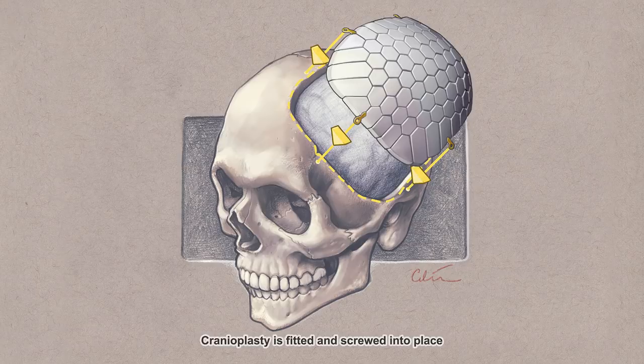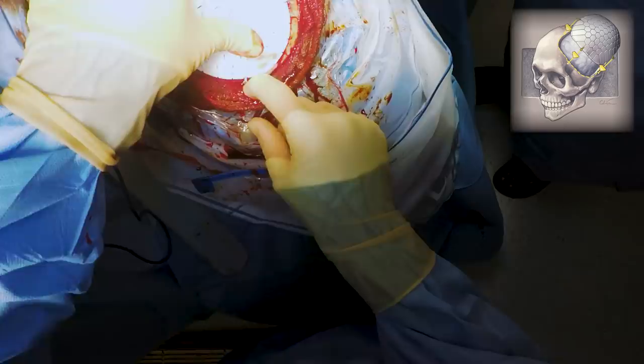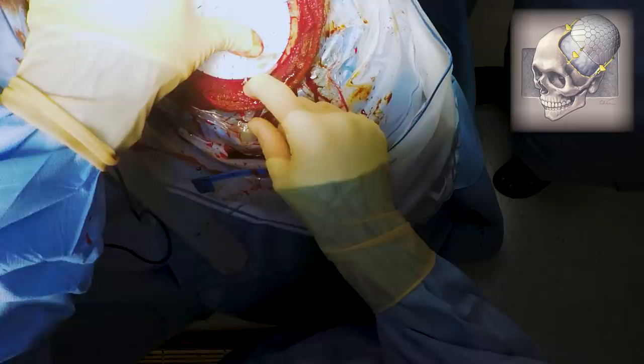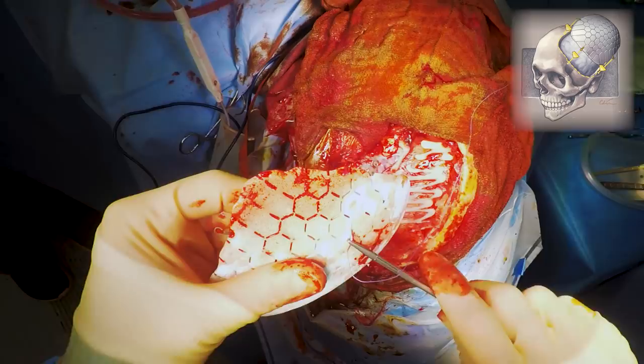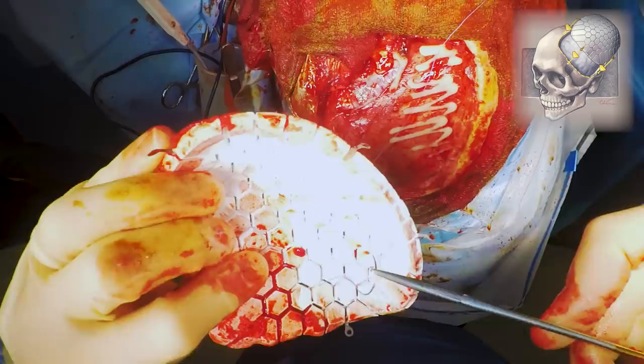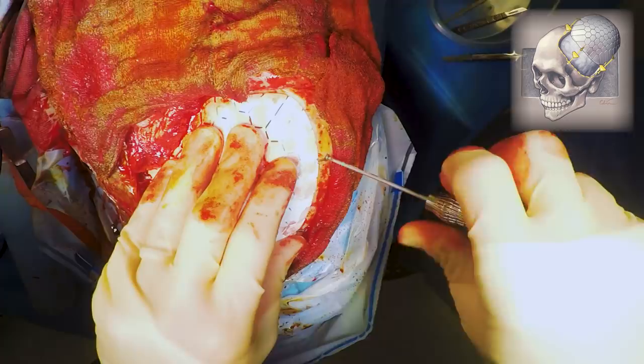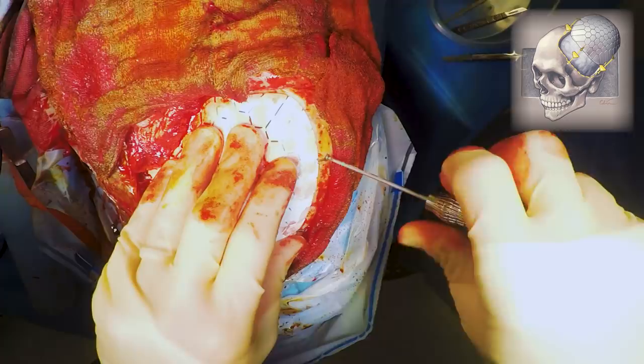At this point everything is ready for the cranioplasty plate to go in. We're going to be using titanium screws to fix the Ostezyne cranial implant into that defect. It's important to make sure that the temporalis muscle can fit over it and that everything is nice and flush. The skull can grow after a certain amount of time and it can mean that we might need to shave away the bone to make sure this fits well. Here you can see Mr Uff putting suture material or stitches through the plate so that he can affix the temporalis muscle to the top of it once the plate is secured. So as you can see there's a nice fit and we're going to start putting titanium screws all the way around into these prefabricated templates that Ostezyne have put in place for us. The placement of all these screw holes is designed carefully bearing in mind how much access we have to those points.